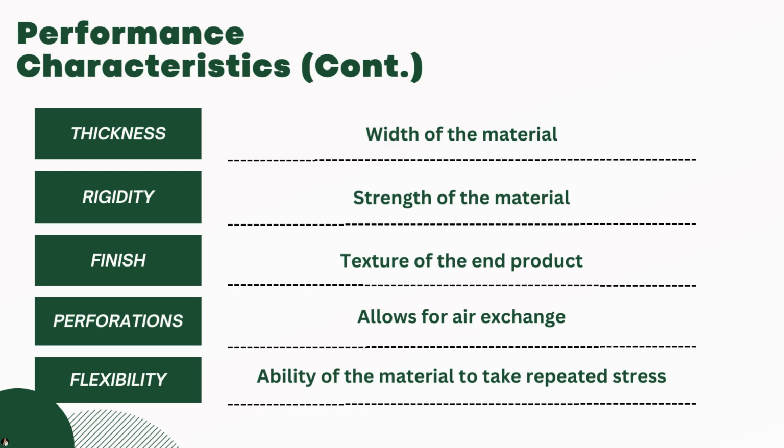Perforations, there is materials that have little holes in them. So this is going to allow for air exchange. So this is going to be good for those with fragile skin, healing wounds. You want that air exchange and oxygen to get to the skin. You don't want to stretch this type of material because if you do, the holes will become larger and it will actually decrease the strength and support of the splint.